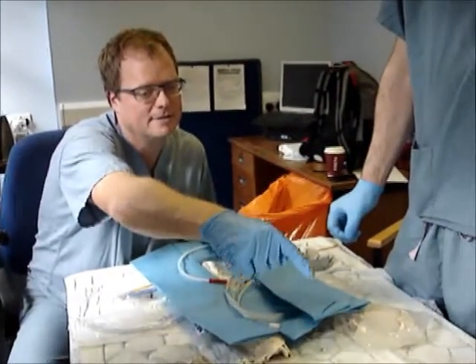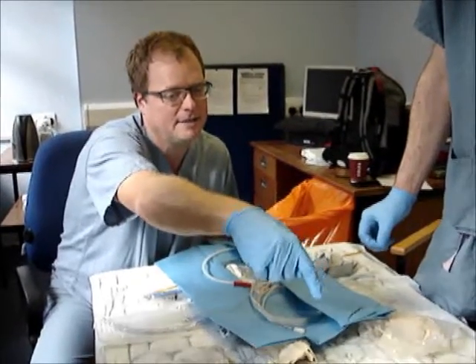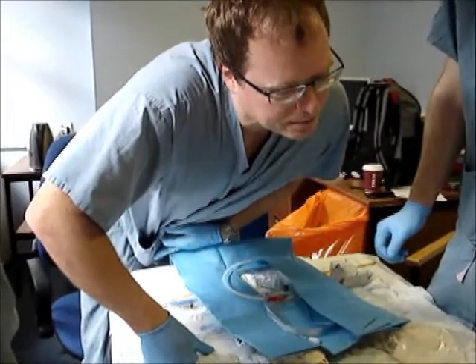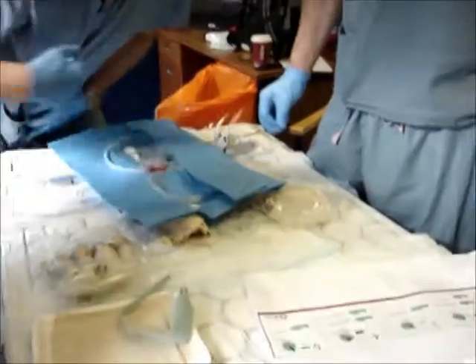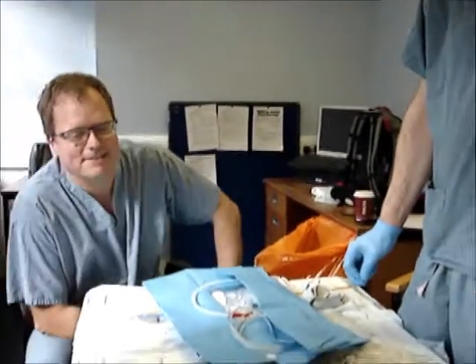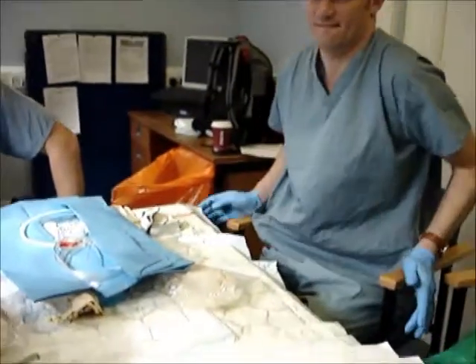Scalpel, dilator, and airway assembly. And brilliant. Yeah, and it's going so brilliantly. Siren, that looks really good. Ideally 90 seconds. Fantastic. Right, so it's going to be on this wrapping. We have the 1, 2, 3.